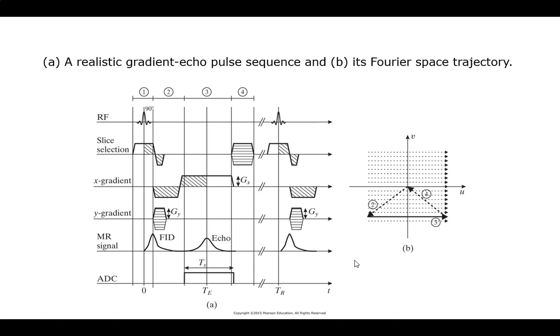So you'll see on this, we've got my slice selection, that's pretty typical. Notice I've got my X and my Y acting simultaneously. X is down. The Y one here is shown as kind of a range because that's just going to determine which one you go to. X down means push over to this end. The Y is shown as a range here because did you want to go up, down? What do you want? In this case, I'm going down. I'm most of the way down, so I'm probably like this one, right? So I've got that as my kick.